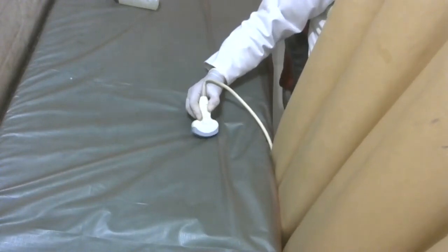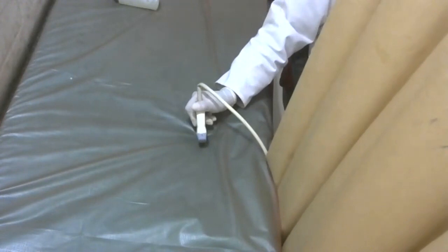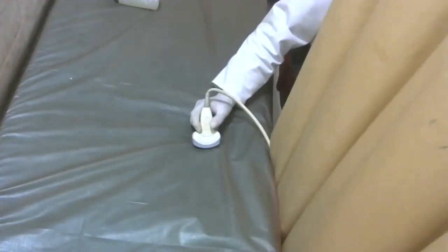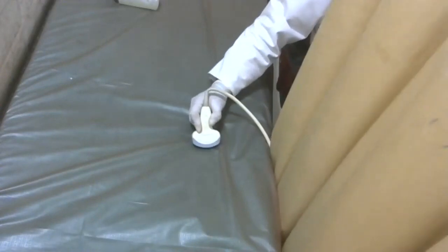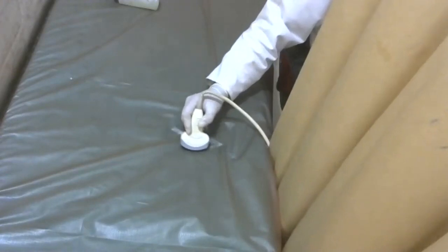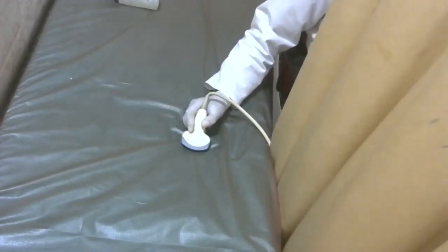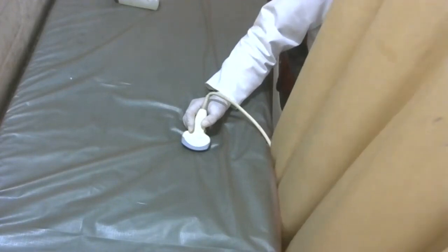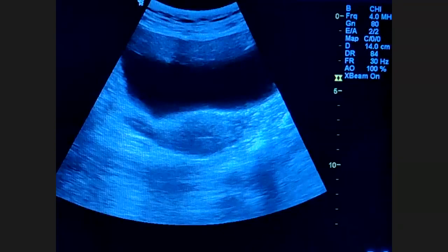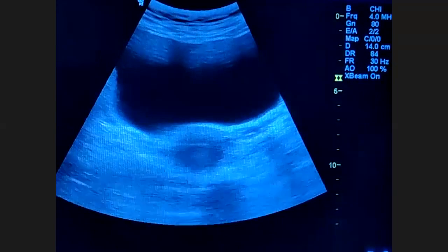Now see, I am showing you the probe. This is transverse, and this way will be the longitudinal section. Done? Now, if I put the probe over here in transverse section like this, whatever image I am seeing on the ultrasound monitor is this. Now see our monitor. Can you see this? Now, question.